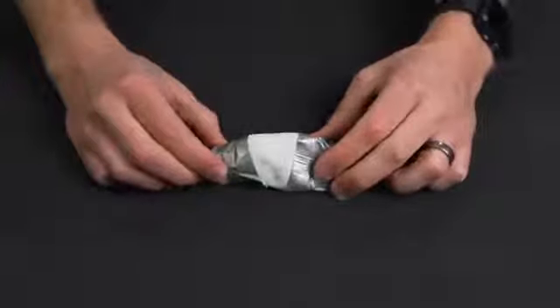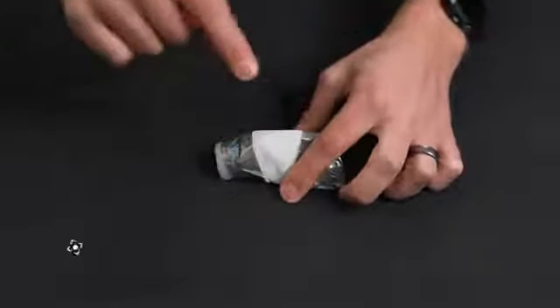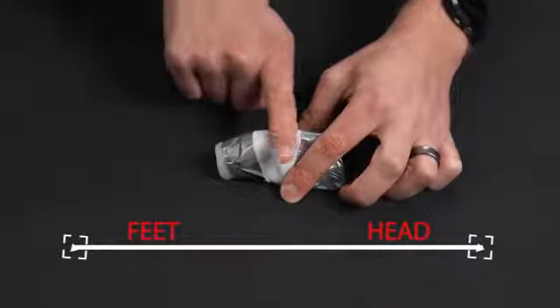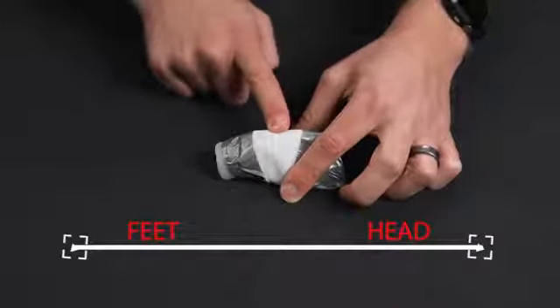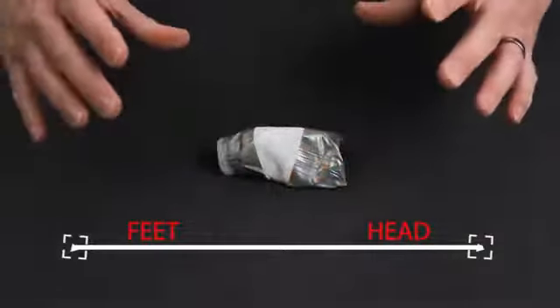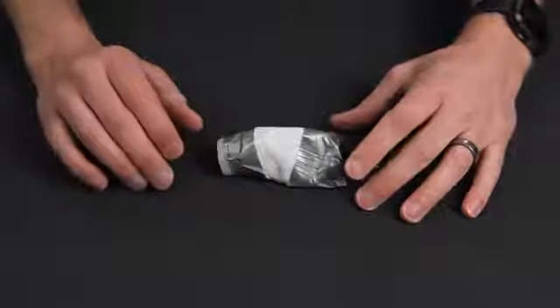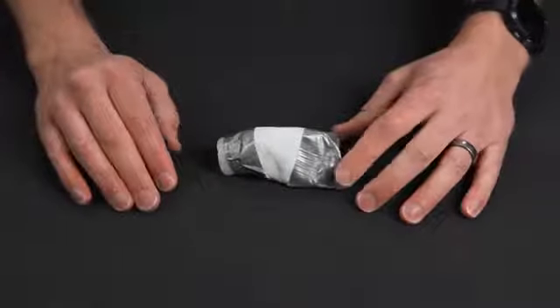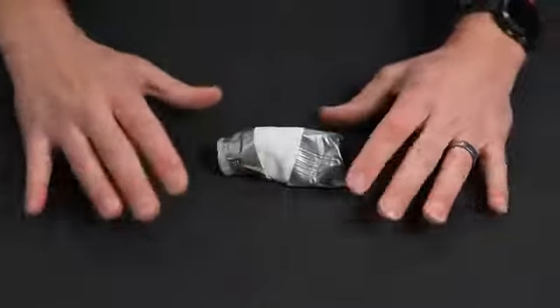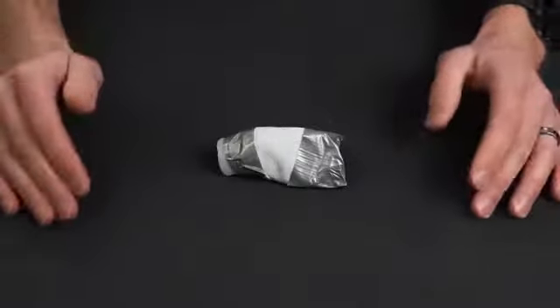So in true prep medic fashion, I have kind of jury-rigged this trainer with a part of a leather glove to simulate the skin, and then underneath that tape to simulate the actual membrane. Now the first technique we're going to do here is going to be kind of the traditional technique, what I was taught originally in school. And then the second one is a little bit more controversial and a little bit more new, but it's what I have been trained to do on the helicopter.